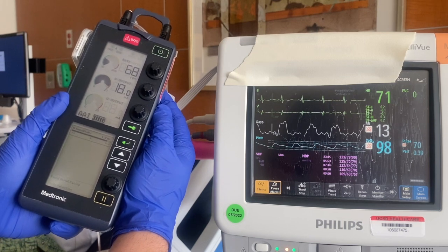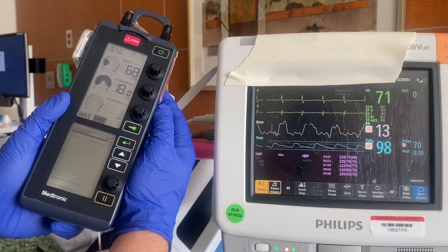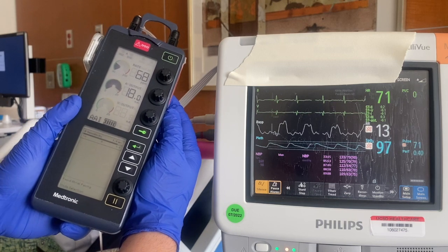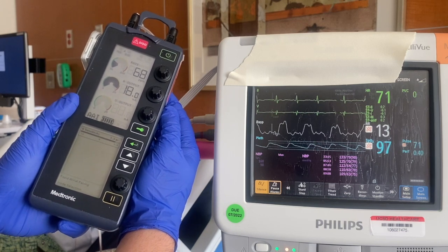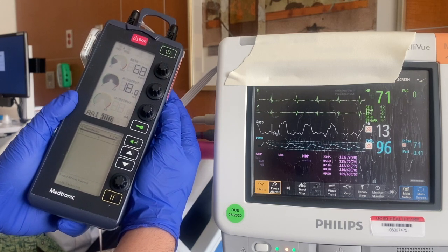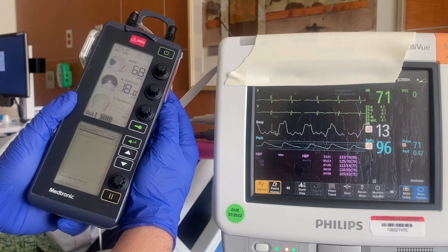You do not want to go below a heart rate of less than 50. If the patient becomes symptomatic, please return to the previous pacemaker mode and rate.